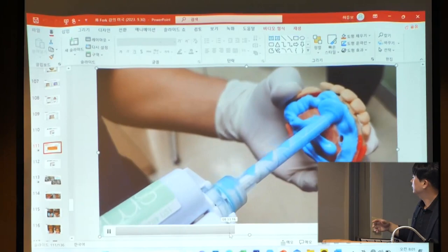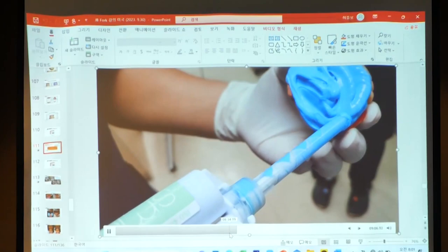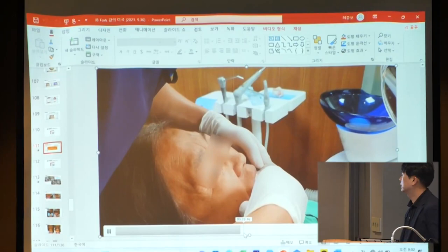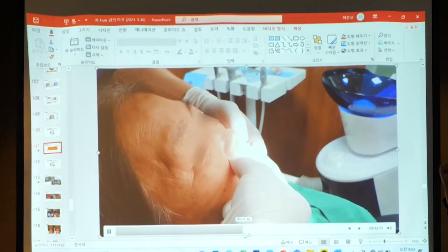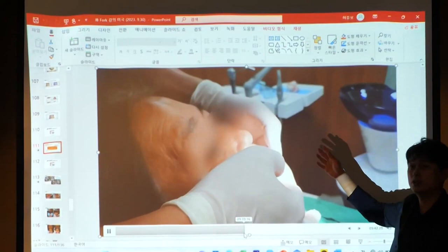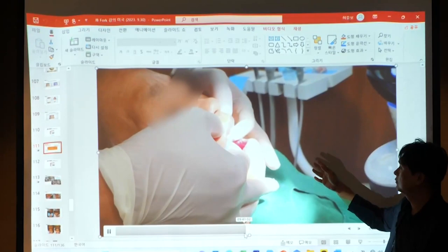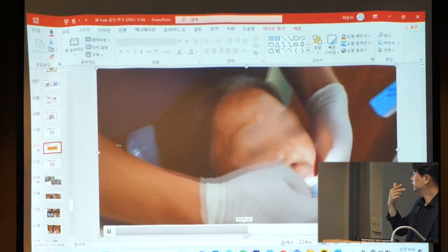So this is the regular body, and then this is this body, and positioned in the mouth. At that time, the patient is looking at the mirror. And then I adjusted the lip support and showed the lip support to the patient directly. At that time, I checked the horizontal plane with the interpupillary line and the middle line. So the patient is satisfied with this position.